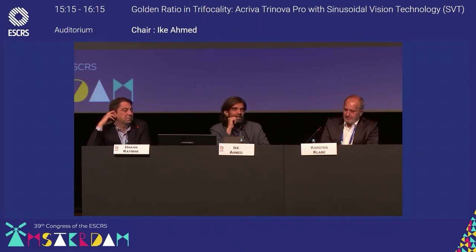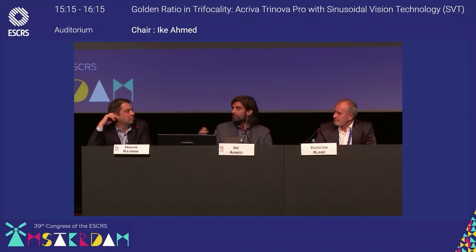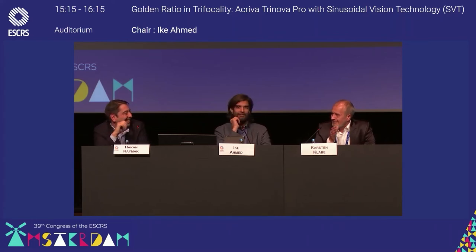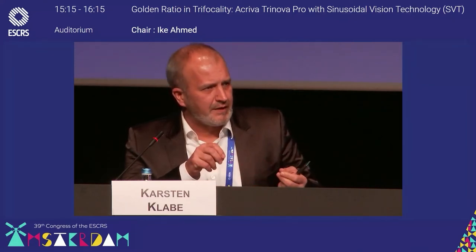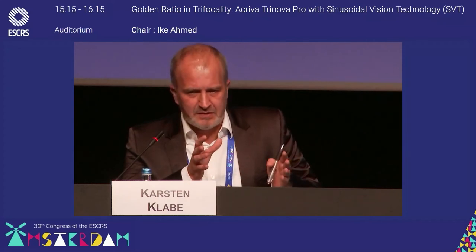Question here: does a plate haptic give you more centration than the C-loop haptic? So what do you think, Dr. Kaymak? Karsten? Normally, yes, but in this case, no. Really? Yeah, surprisingly. The design of a plate haptic implements an immediate centration of the lens, and with the C-loop, I was surprised about the perfect centration at day one. Probably with the support of the capsular tension ring. But the material of the lens is stiff enough, and the haptics are equally elastic on both sides, so there is an excellent centration. I think it's not an issue anymore.